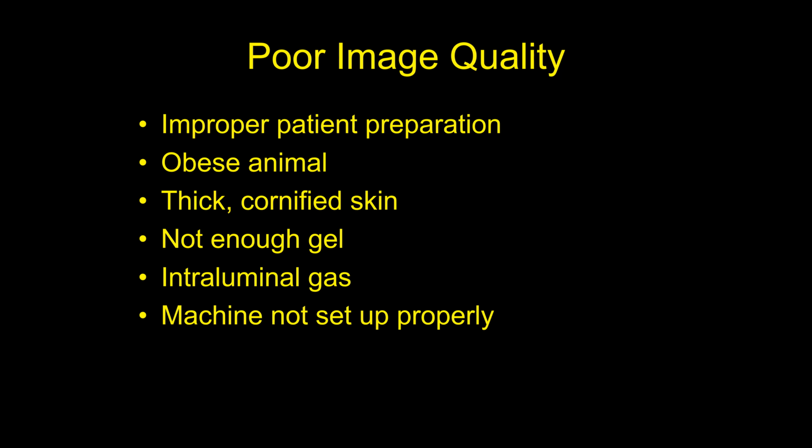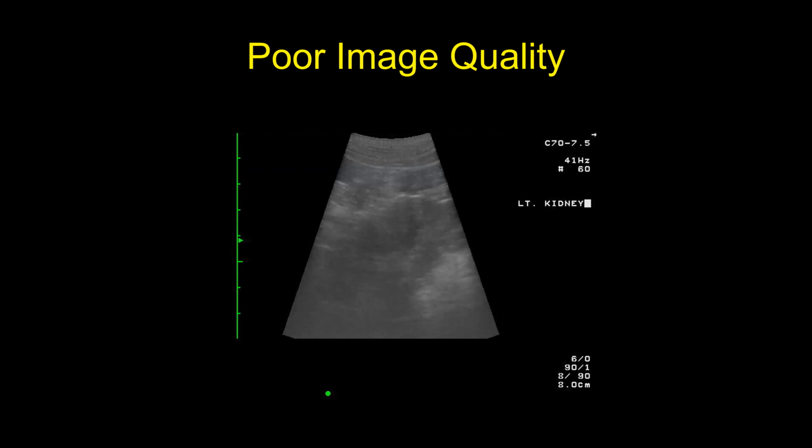And the other thing is your machine's not set up properly. The gain's too low, the depth of the image is too high or too low. So you don't know how to work the machine, you don't know what the knobs do, and the machine's not set up properly will cause poor image quality.